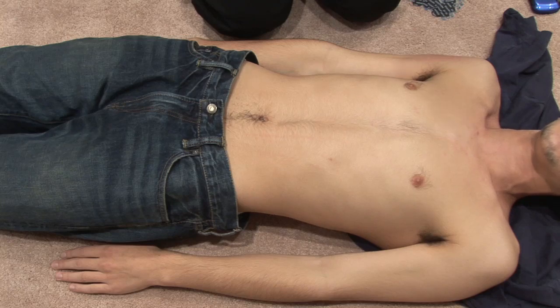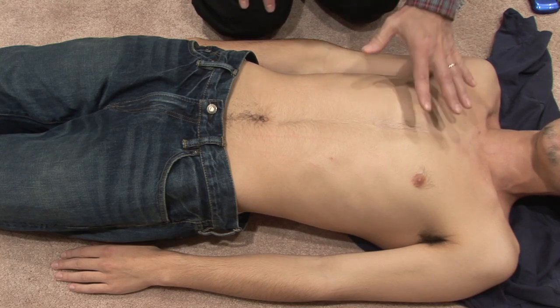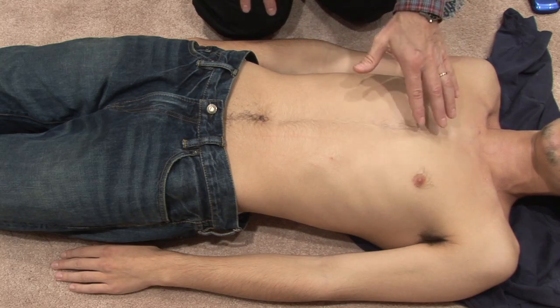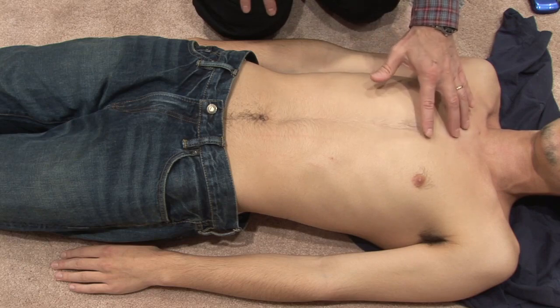Hey, this is Dr. Nick from the ECG Academy, and we're going to go over the anatomy of the chest, because in order to put the ECG electrodes in the proper place, you have to be familiar with the anatomy. I've seen a lot of people put the ECG leads in the wrong place, the electrodes go in the wrong spot, and then it makes the ECG look abnormal when it isn't. So let's go over the anatomy of the chest.